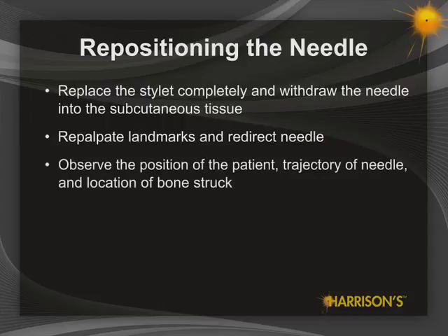It is helpful to carefully observe the position or angle of the patient, the trajectory of the needle, and the location of the bone that has been struck prior to withdrawing, so that you may subtly redirect and reinsert the needle. This will ensure a methodical rather than haphazard approach to locating the spinal fluid-filled space.